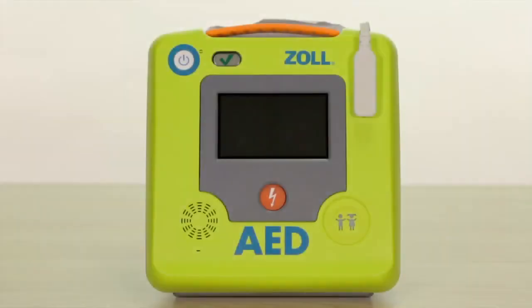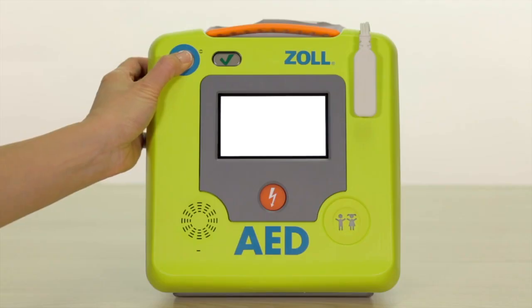To access touchscreen configuration options, you will need to place the AED3 in configuration or non-clinical mode. You can do this by simply holding the on button down for about 7 to 10 seconds. You should hear a click and the AED3 will display a blue Zoll logo screen.